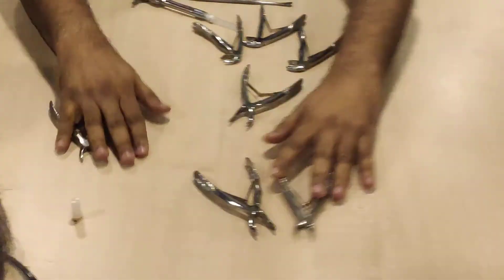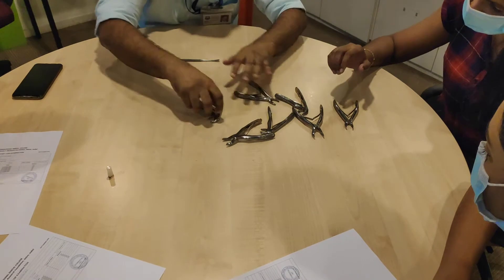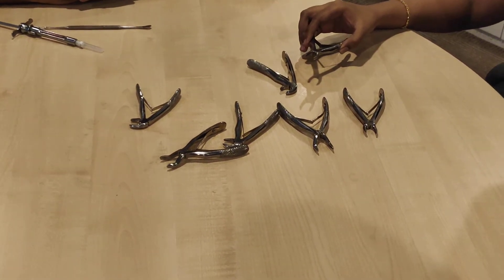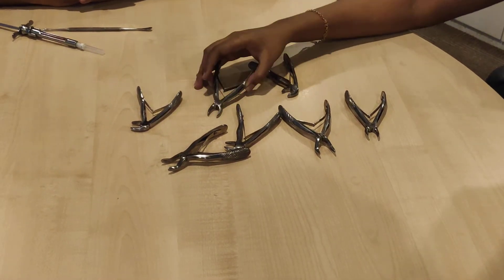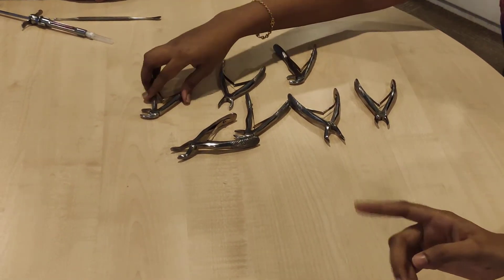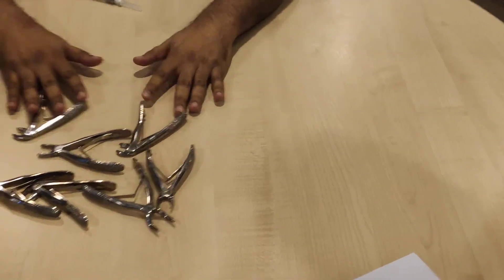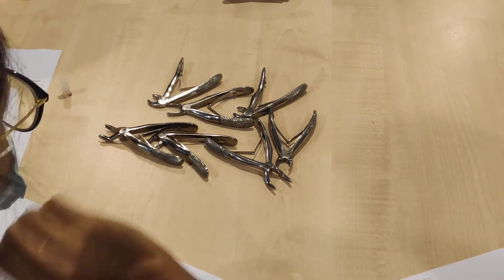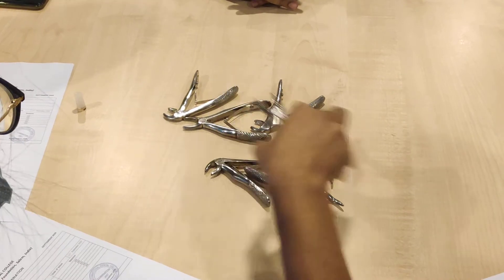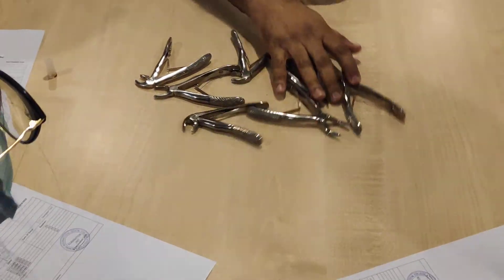Let's see — 8-1. Just visualize where 8-1 is. Very good. 8-1. Excellent. So you must know which forcep to pick. 6-5. Yes. How confident are you? Correct — has to be that one. Among these, has to be that one. That is correct. We'll do one last one.